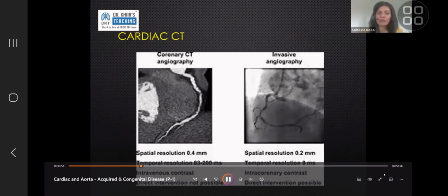So coronary CT angiogram, or CTCA, or cardiac CT, is now roughly considered a replacement for invasive diagnostic cardiac angiography. Decades ago, radiologists or interventional radiologists used to do cardiac catheter angiograms. Over time, CT has stepped in. Now, cardiologists in some places report CT cardiac angiograms. So there is an overlap in how the world has evolved over the last few decades.